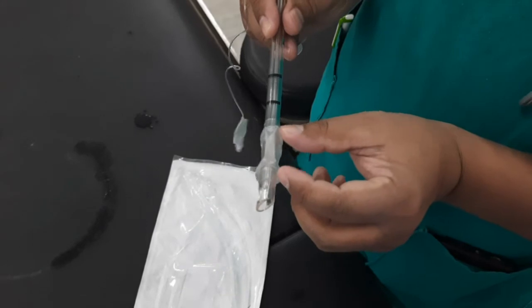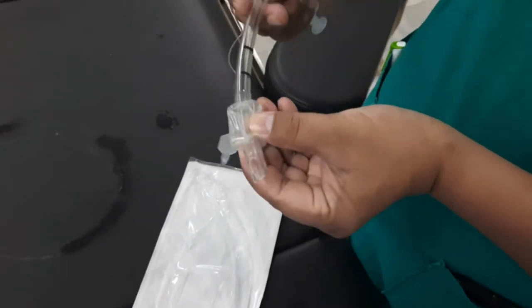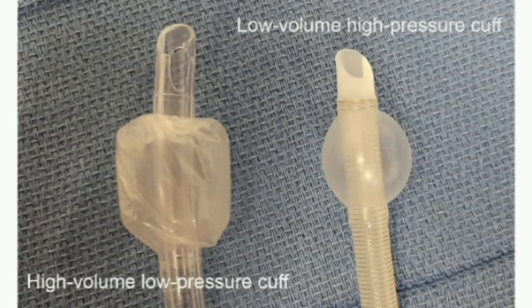Generally speaking, there are two types of endotracheal tube cuffs in use: high volume, low pressure cuffs and low volume, high pressure cuffs. When the cuff is inflated, it forms a seal against the tracheal wall. This seal prevents gases from leaking and allows positive pressure ventilation. The seal also prevents matter such as regurgitated gastric contents from going into the trachea.